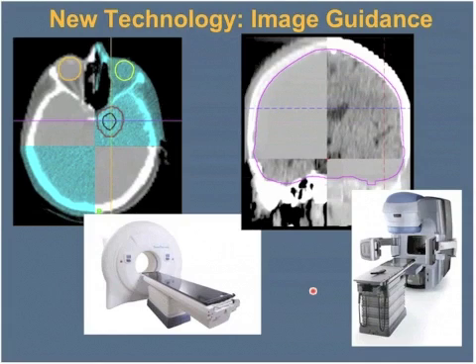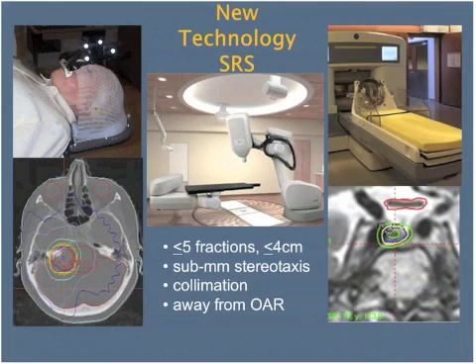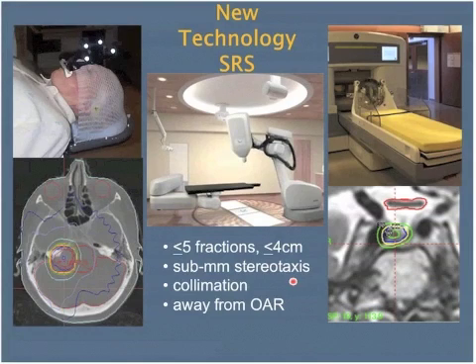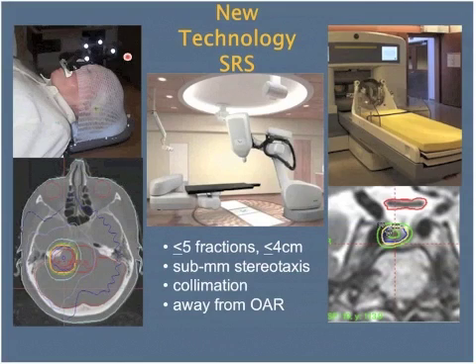So we basically have two different common platforms for delivering intensity modulated radiotherapy, and they both can do a good job. I won't talk much about radiosurgery except to say radiosurgery and stereotactic radiotherapy takes all of these principles and just takes it up a notch in terms of the degree of stereotaxis and localization and beam collimation that allows you to be even more focused in your delivery, and allows you to use larger dose per fraction safely by shaping and targeting the beam precisely. So in this case, a cerebellopontine angle meningioma, and you can see a very sharp dose gradient being delivered using a non-invasive stereotactic frame with an optical fiducial bite block system. In this case, a CyberKnife system.